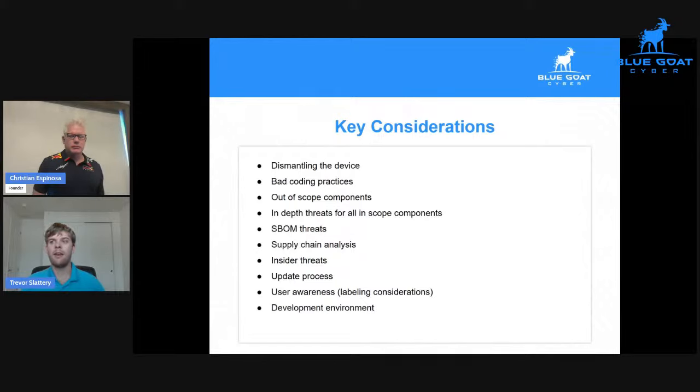Now, while of course this is great to have that update functionality and the ability to make changes to the system, it needs to be considered from a security perspective as well. If you're doing over-the-air updates, you're going to connect into a network. You can potentially be on the open internet. If you're on the internet, you're much more likely to have attackers try to attack the device. So it is a bit of a double-edged sword, understanding what can happen by introducing a secure update procedure. You can still introduce some risk in and of itself.